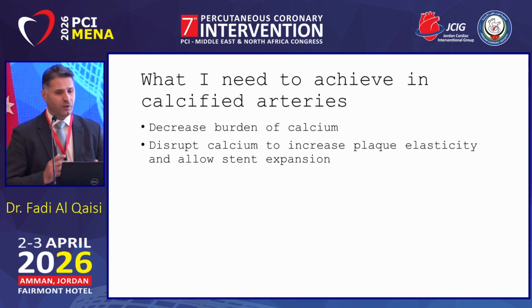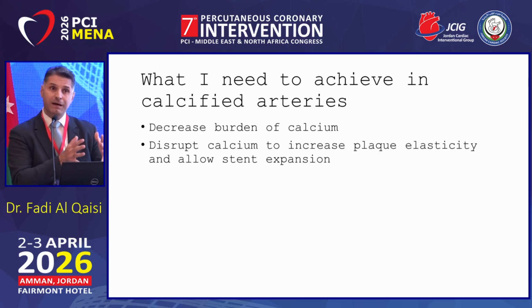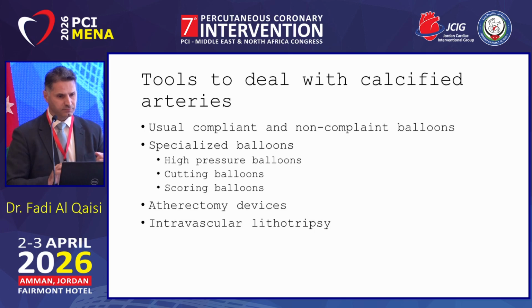But what do I need to achieve in calcified arteries? I have to decrease the calcium burden, shave off. يعني بدنا نسنفر الارتري ونشيل الكالسيوم ونحط الصخر. الشغله الثانيه I need to disrupt the calcium. بدي اكسر الكالسيوم بحيث لما يدخل البالون يكمل عليه. بدي احط شق في الصخره حتى اقدر اكسرها بالبالون تاعي.